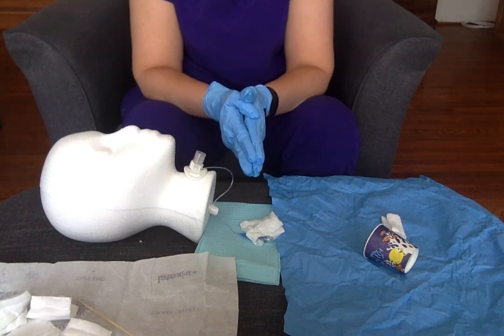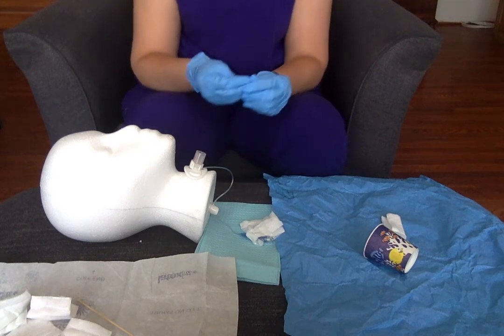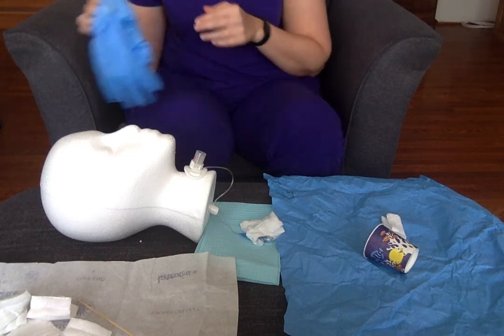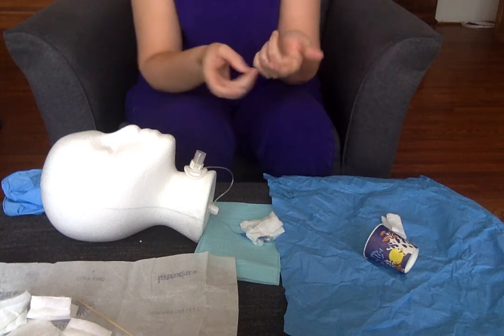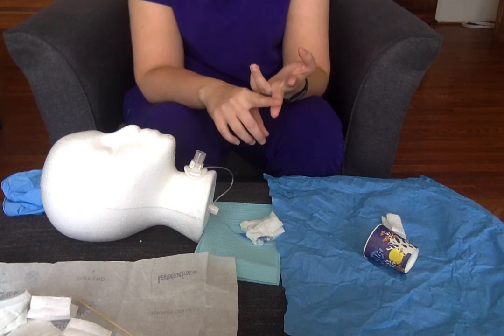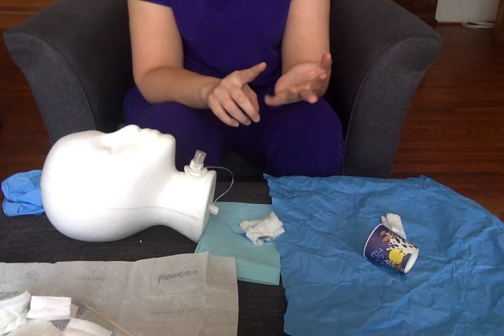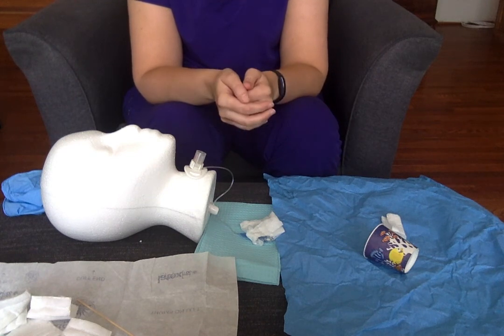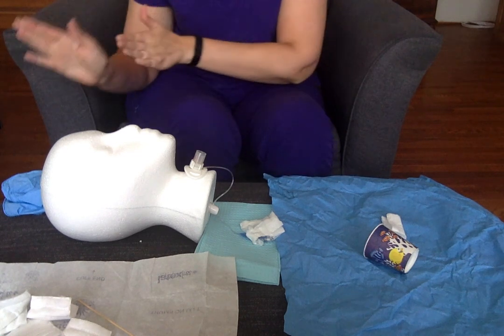And that is kind of the basics we expect you to know for your tracheostomy dressing change and care. At this point, you would clean up and do your safety checks — remove your gloves, do hand hygiene, clean up all supplies and dispose of them. Check that the bed is in the lowest position and locked, that you have an appropriate number of side rails up, and that their call bell is within reach. Those are all QSEN safety items to make sure we avoid patient injuries and falls. Then thank the patient for their time and do hand hygiene on your way out the door.